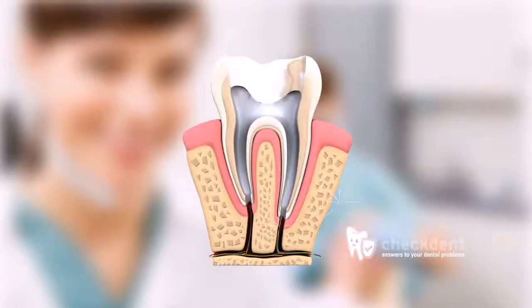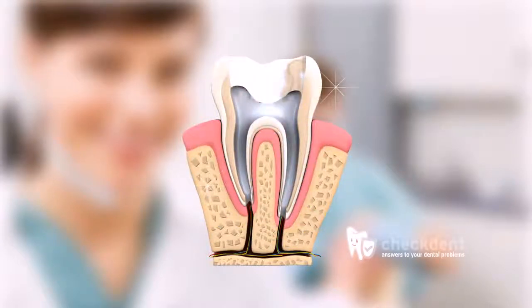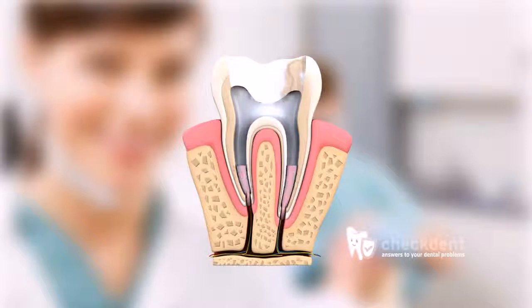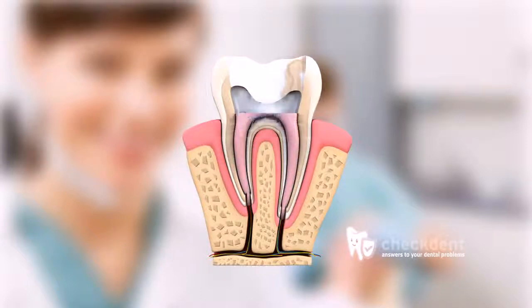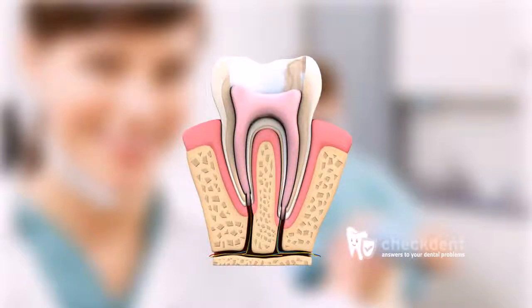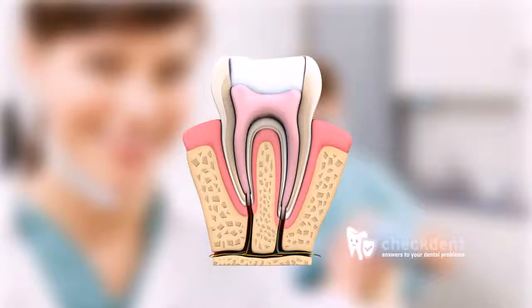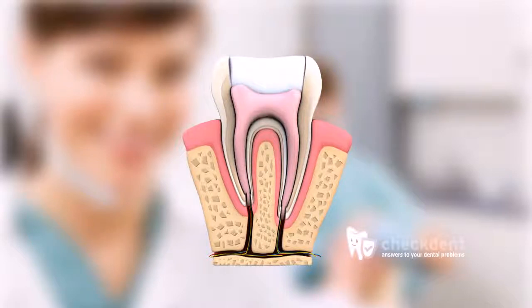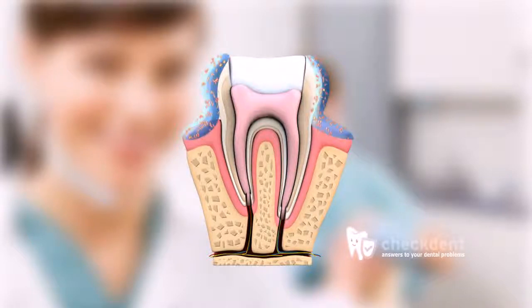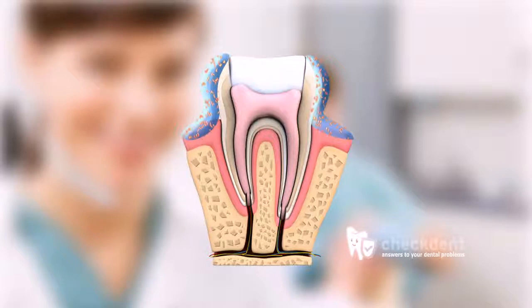Once the canals are clean and the tooth no longer causes any discomfort, the canals are tightly filled with a special compound, creating a tight apical seal. The tooth crown should also be tightly sealed from the top, in effect from the access opening, because only then is it guaranteed that bacteria can no longer enter.